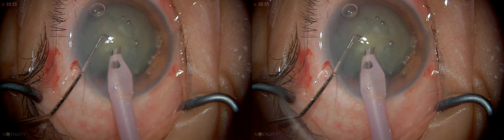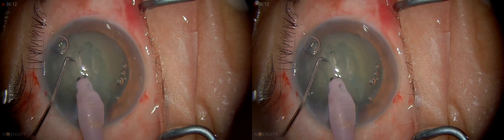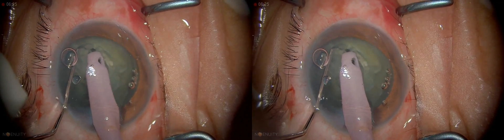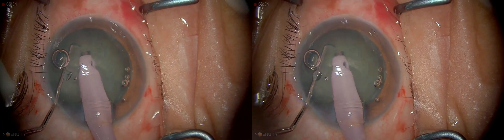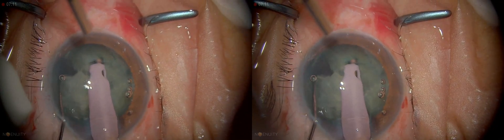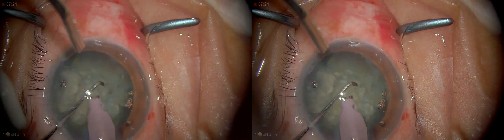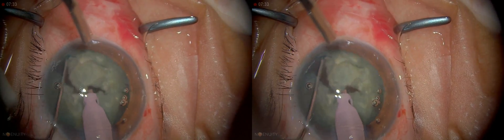So now I'm going to start the phacoemulsification and I'm going to go in with the infusion on. This is a reasonably hard cataract. I'm going to make a small groove here because that is also one way in which it can be done. Yesterday I did horizontal chops — so this is a vertical one. It's very important to try and disassemble the nucleus prior to commencing its removal. I've disassembled it into four pieces, four quadrants, and this one is the largest.